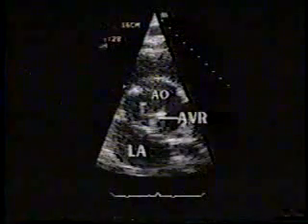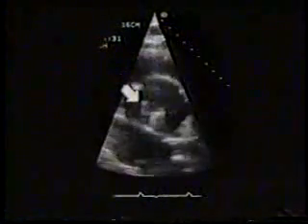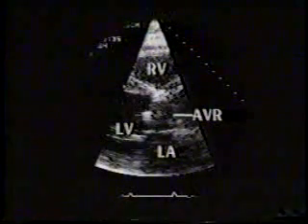This patient has a ball cage aortic prosthesis. This is the cage within his enlarged aortic root. The prosthesis rocks freely, indicating a large dehiscence. This is the aortic prosthesis. The sewing ring has separated from the aortic annulus, which is here. The prosthesis has rocked into the LVOT. This will be more apparent in real time.